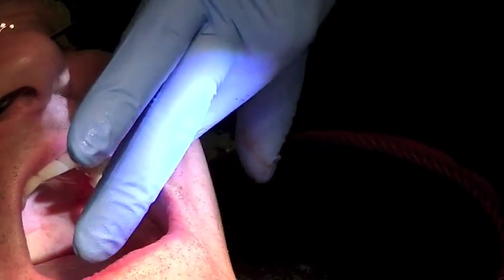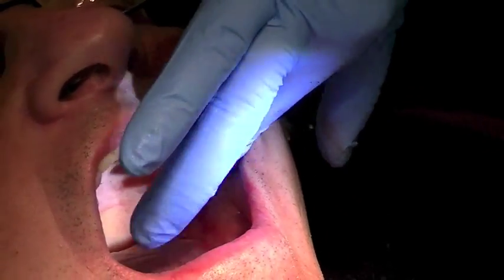Nice extraction site — atraumatic. The buccal wall is still intact and that's what my goal was.